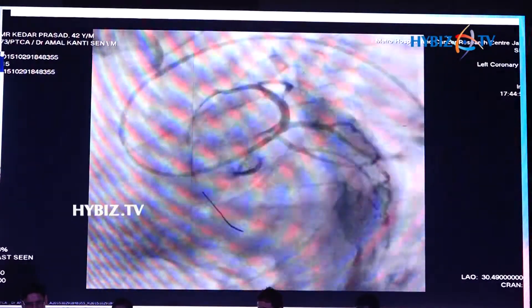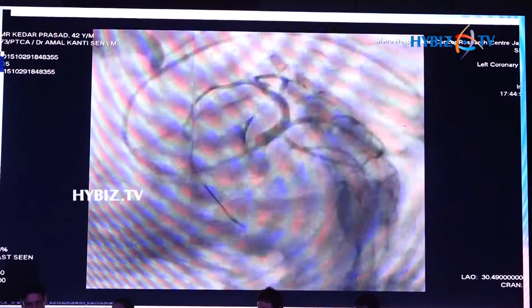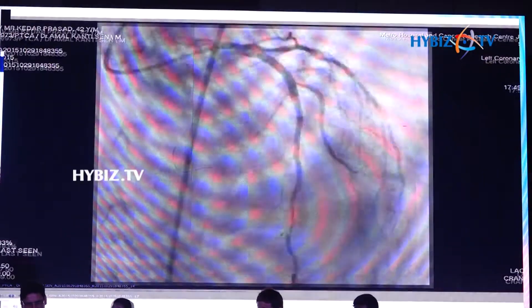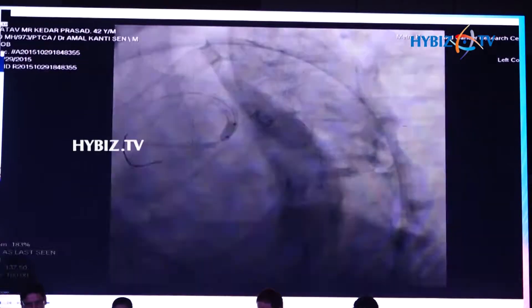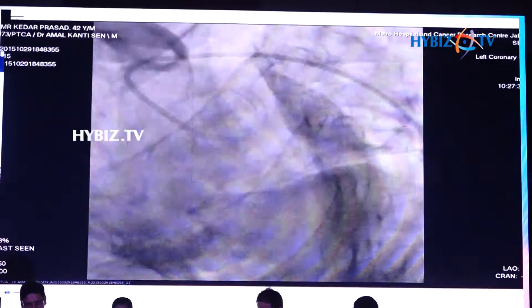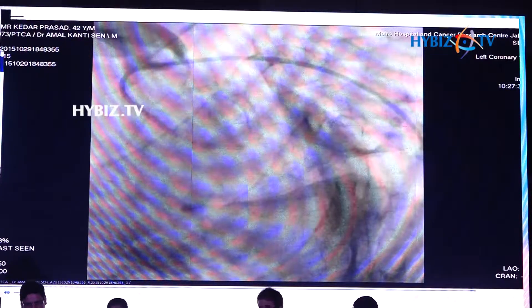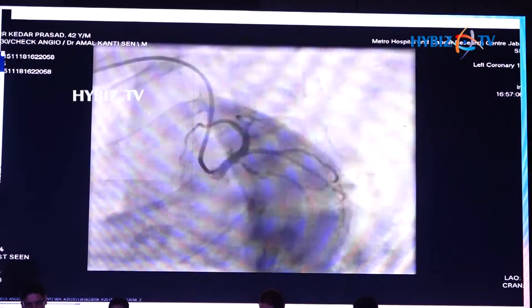The patient was still stable, so we thought about what to do. Then we did thrombosuction and tried to remove the clot. We also dilated that area to try to pinch the clot, but it still remained. We tried again and it remained.